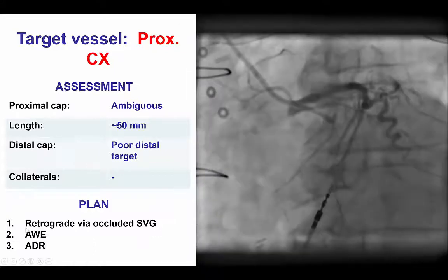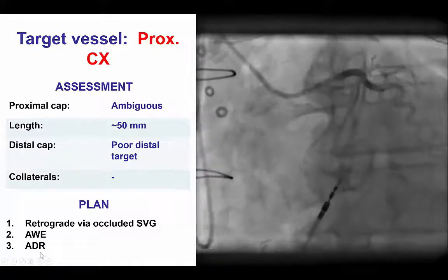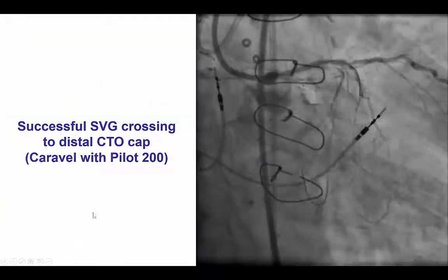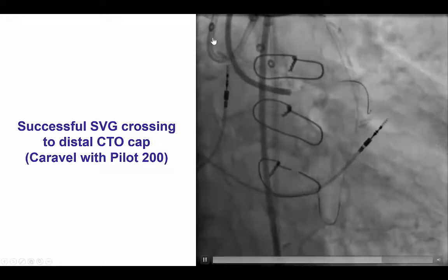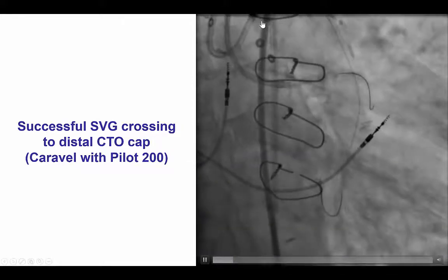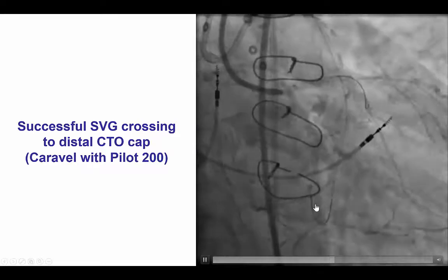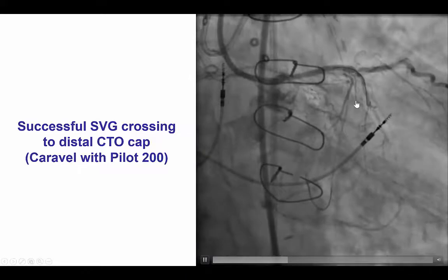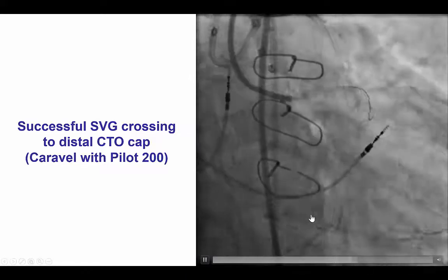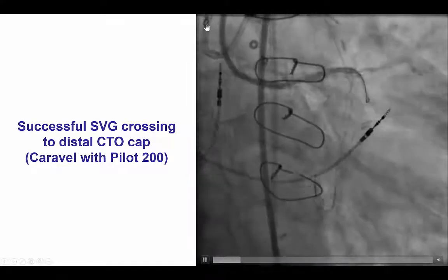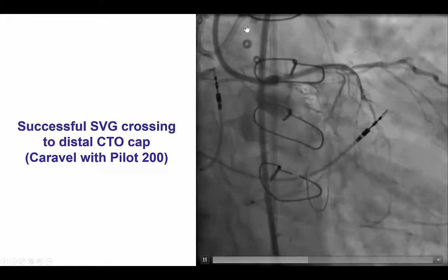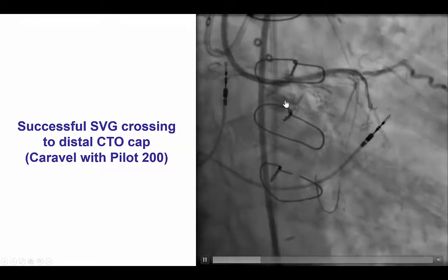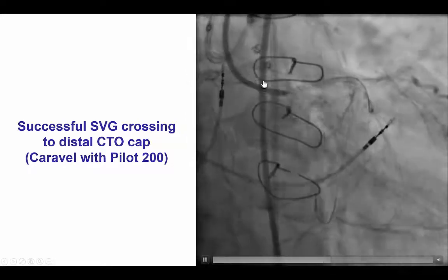If retrograde failed, the plan was to change to antegrade wire escalation or antegrade dissection re-entry. As hoped, we were able to fairly quickly advance a retrograde Pilot 200 guidewire over a 150 cm Caravel microcatheter all the way through the vein graft into the distal vessel and start retrograde wiring. We used an AMPLATS AL1 8 French guide for the retrograde attempt in addition to a 3.75 8 French EBU for antegrade.